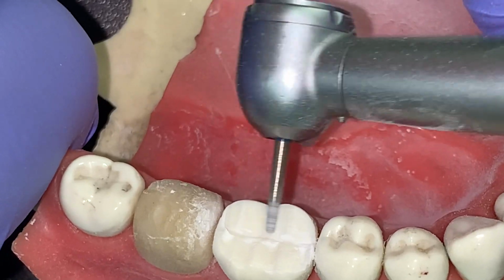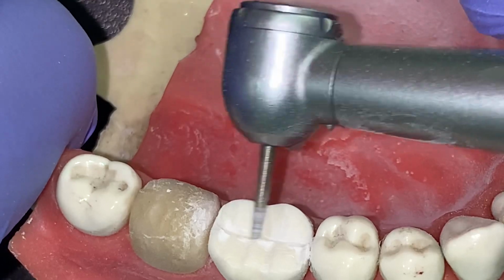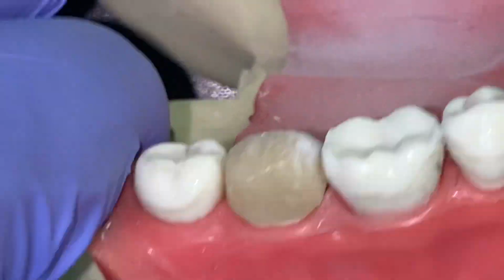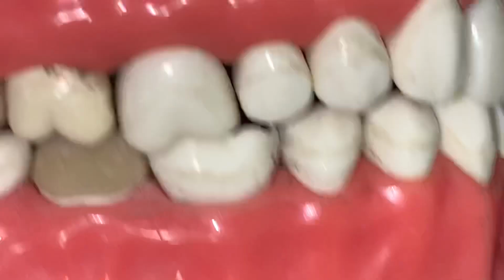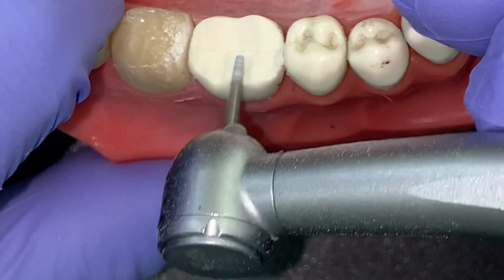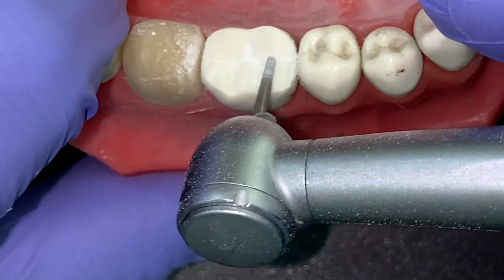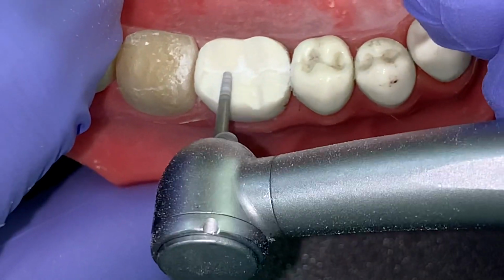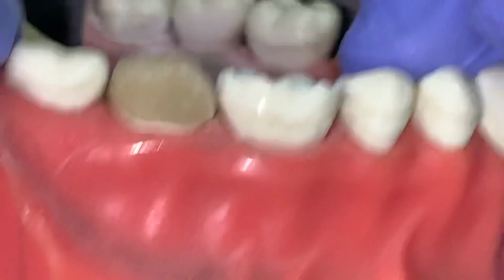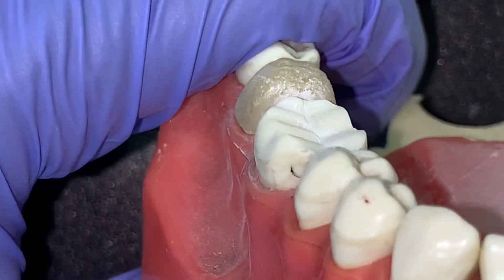Here I started with the lingual cusp reduction. So if you see clearly, our reduction is deficient in the occlusal surface right now. If you watch closely, I am following the contours of the tooth. I am following the occlusal surface of the tooth. See, I have not made the occlusal surface totally flat.